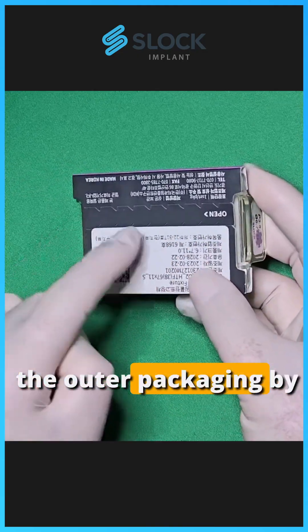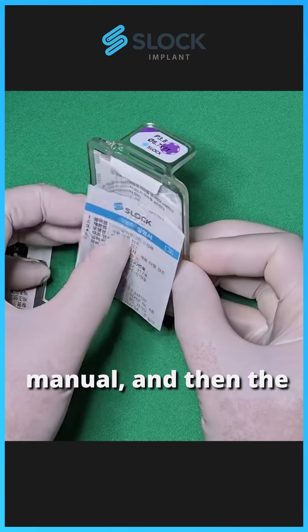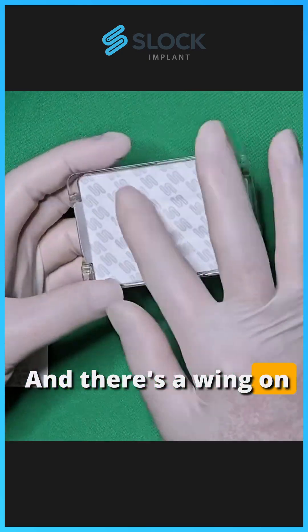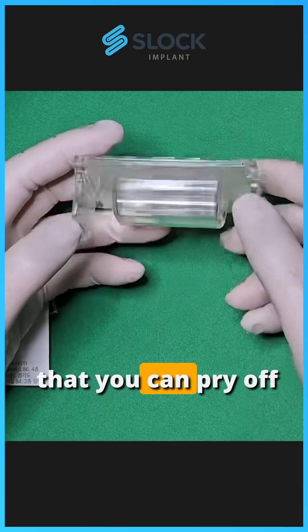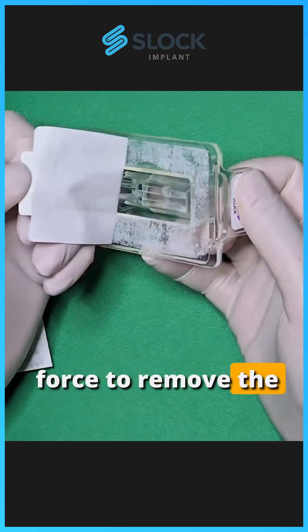First, we'll tear off the outer packaging by following the cutout in the back, and then remove the user manual, and then the Tyvek blister is sealing the plastic case. There's a wing on one side or both sides that you can pry off like this, and you can pull them apart with force to remove the Tyvek blister.